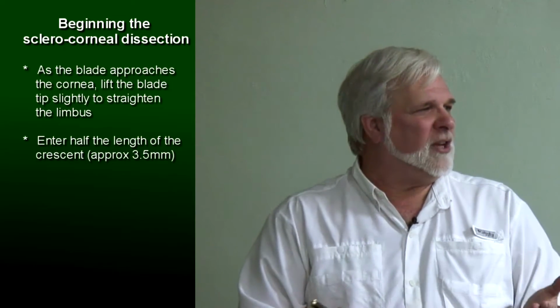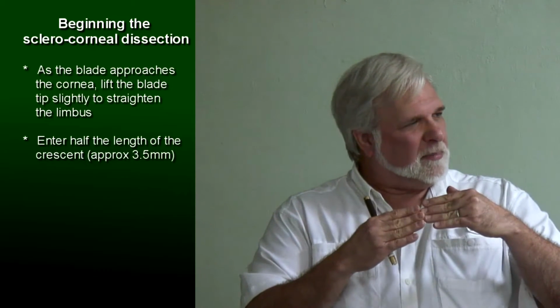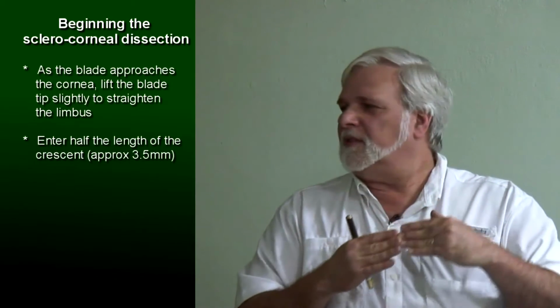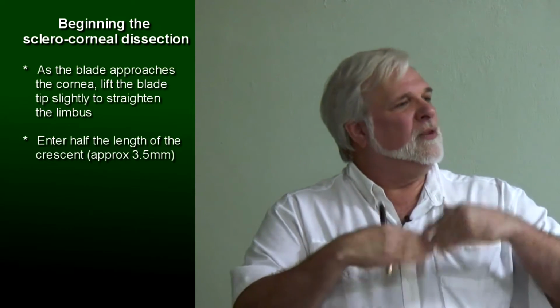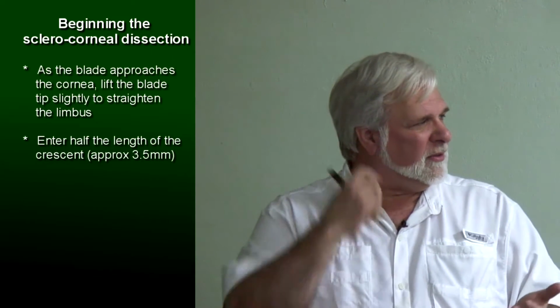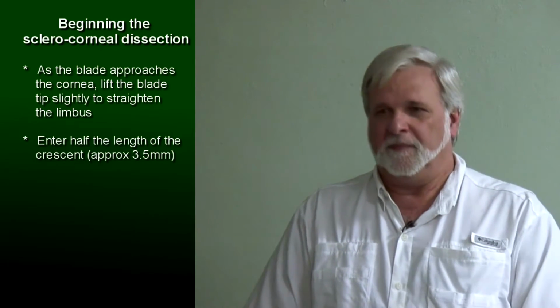Well, you change the shape of the eye, is how you compensate for that. You can't change the shape of the blade, but if you lift the tip slightly, it straightens the limbus out. And then you can proceed with your dissection in one plane, because that's all the blade will do. You can't change the angle of the blade. You can't change the shape of the blade.